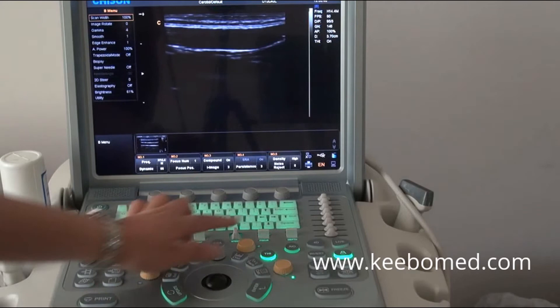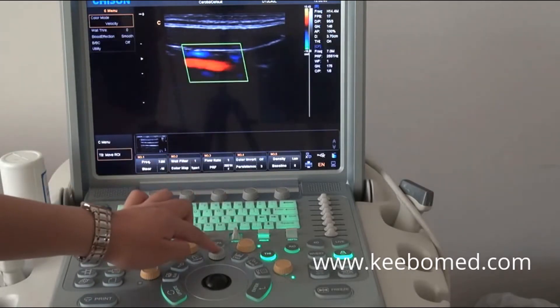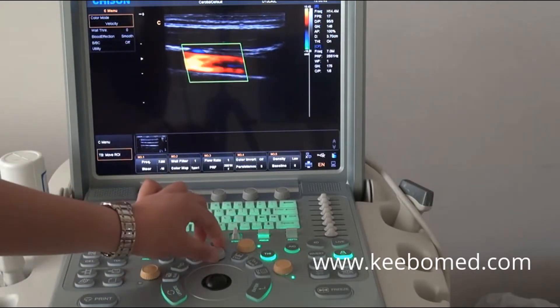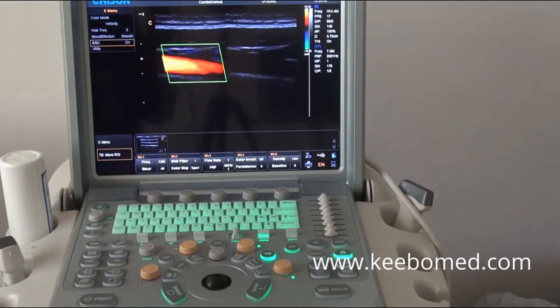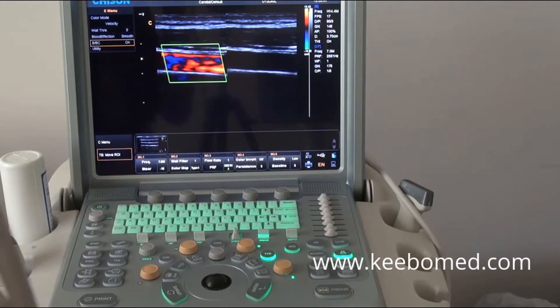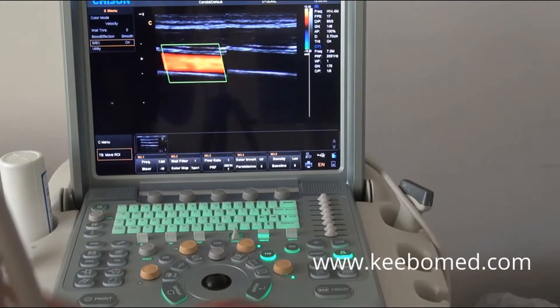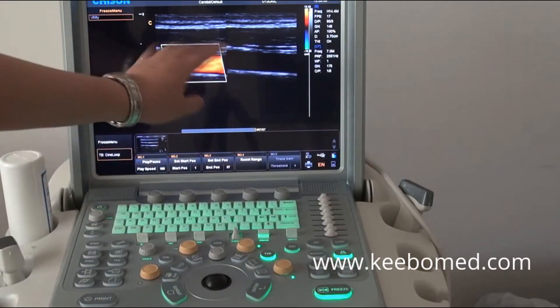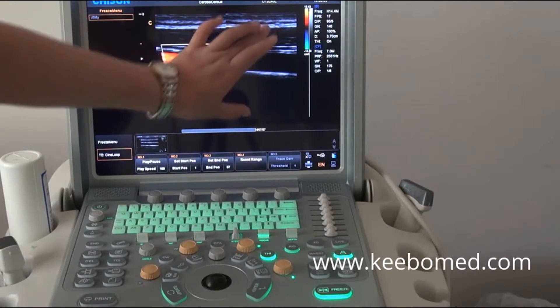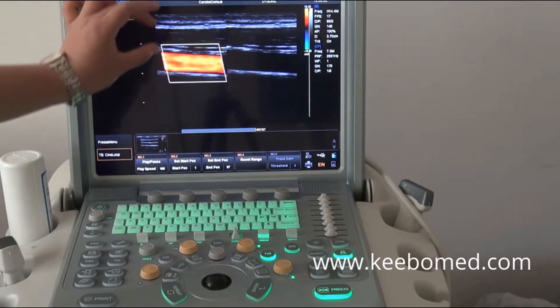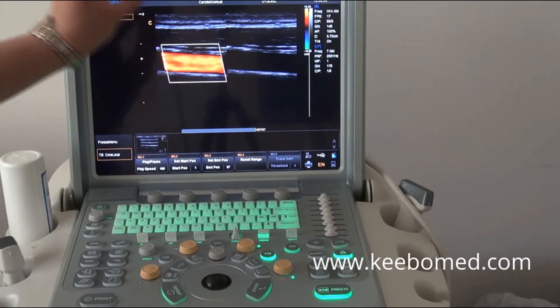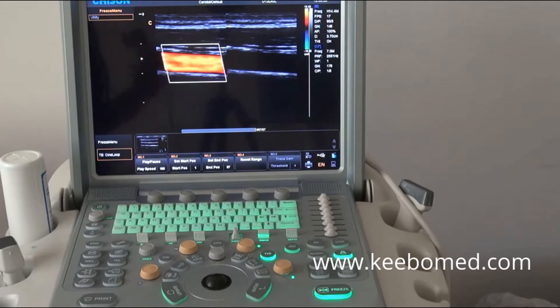After that, enter C mode and press the menu key to open the BBC mode. You will find one is the black-and-white image and another one is the color image. The color image and the black-and-white image can be displayed on the screen at the same time.